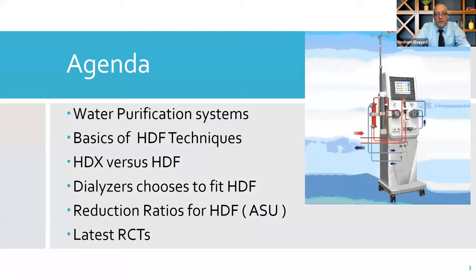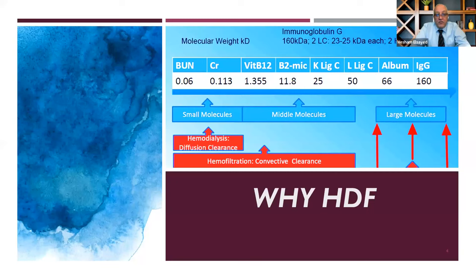We will talk about water purification systems, basics of HDF techniques, expanded hemodialysis versus hemodiafiltration, how to choose dialyzers suitable for hemodiafiltration, how to implement that in clinical practice, and then we'll go to our Ain Shams University experiences in reduction ratios and other publications, and we'll finish with the latest randomized controlled trials, starting from the Turkish study and ending with the CONVINCE study.